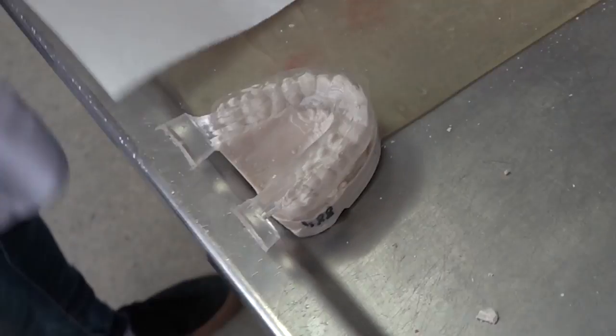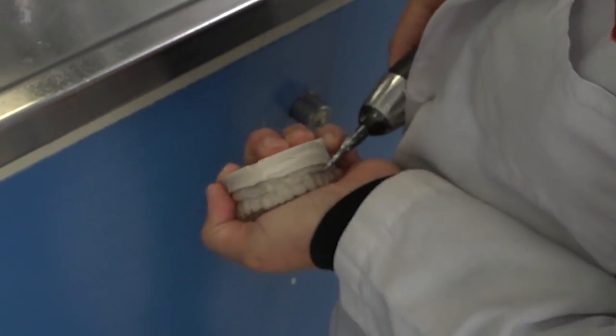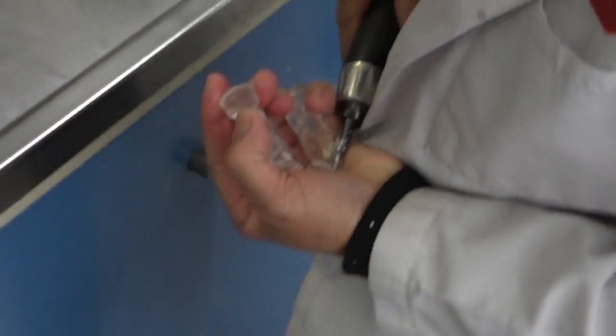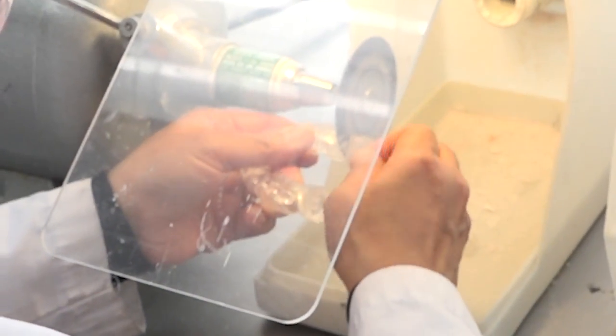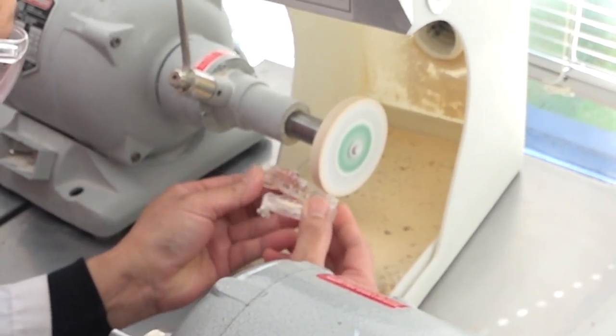Remove mold from frame. Remove model from mold. Chisel model off of night guard, clear away debris, cut off pouring stumps, and trim away excess from night guard.